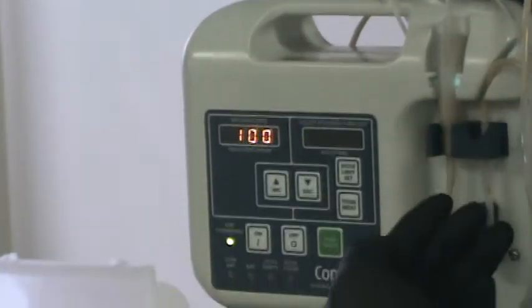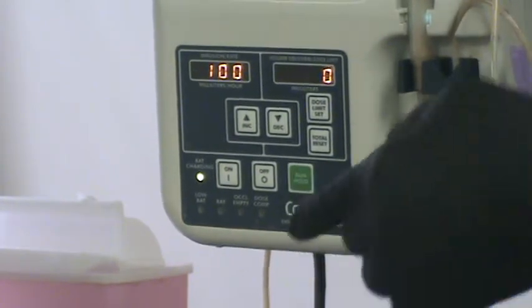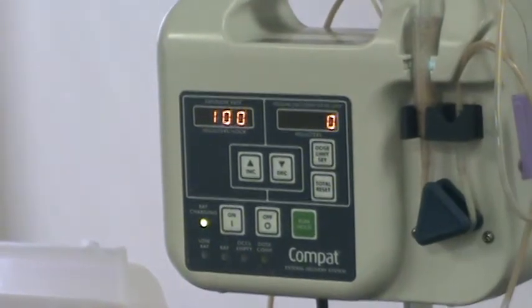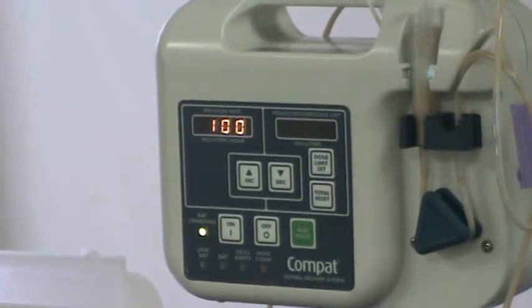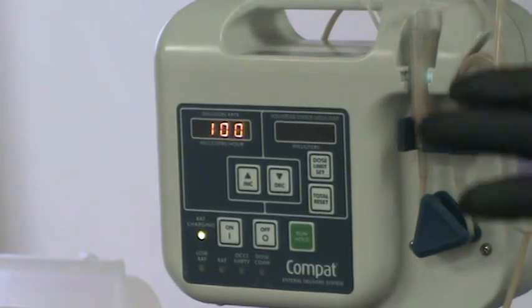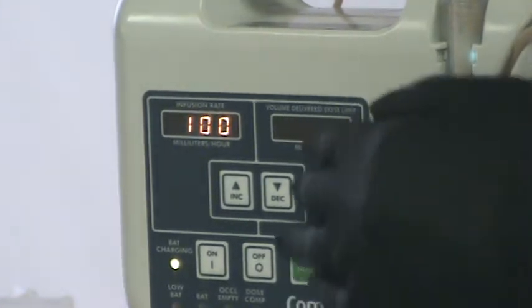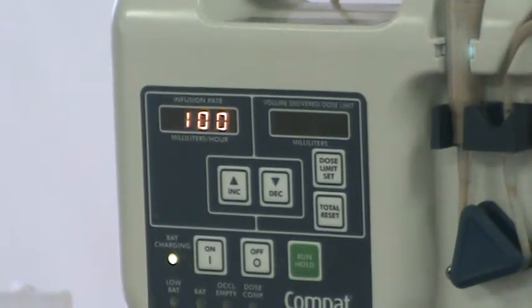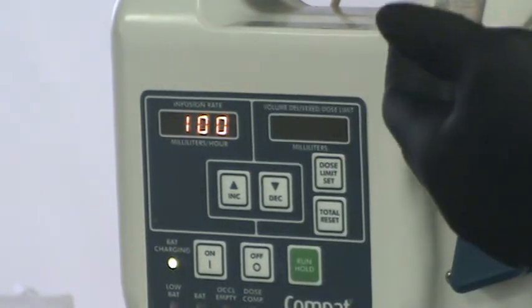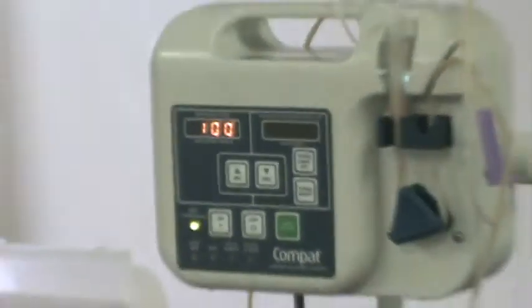So the feeding is on. You want to provide care, put it on hold. The hold will give you 5 minutes to do whatever you need to do. If you need an additional 5 minutes, it will beep when it's 5 minutes, then you press it again to give you another 5 minutes if you're not done. But putting it on hold serves as a reminder in case you forget. The machine will beep that it's not on, so that way you can come back and turn it on. All right. Okay, so we're done with that.